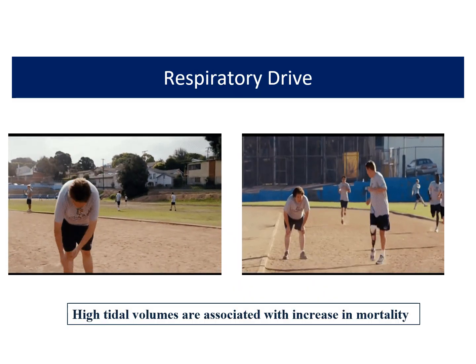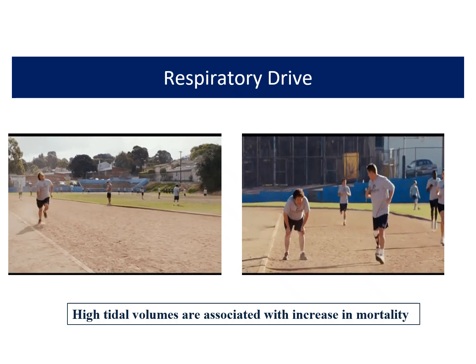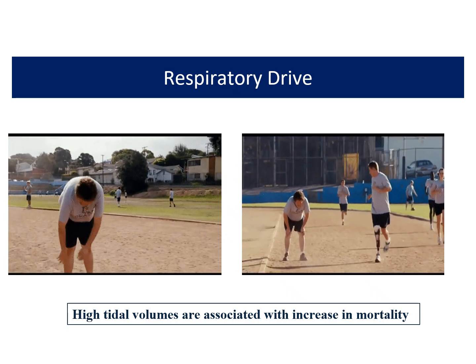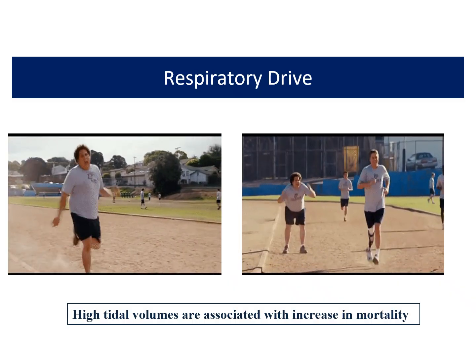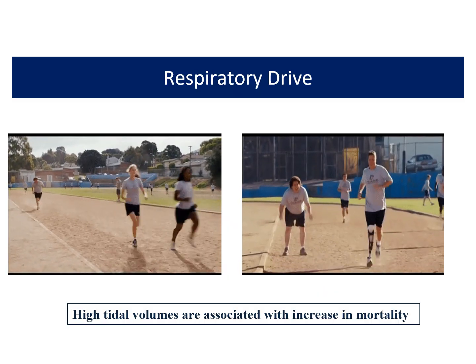He is not going to take it. He is going to have a bad respiratory effort. Sometimes it could be just because of the anxiety or air hunger. So if you give a little bit of FiO2 oxygen to the patient and give an analgesia, probably a little bit of sedation, many of these patients can have a decreased respiratory drive where you're able to manage.